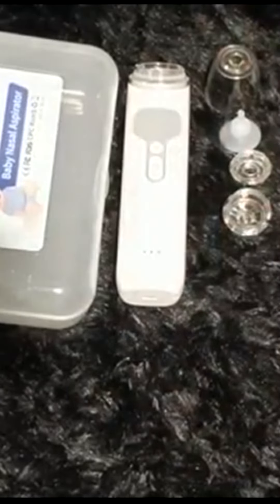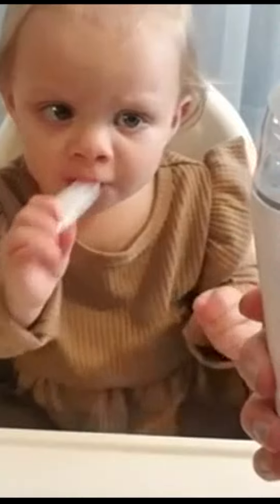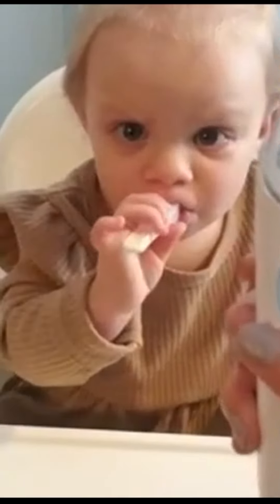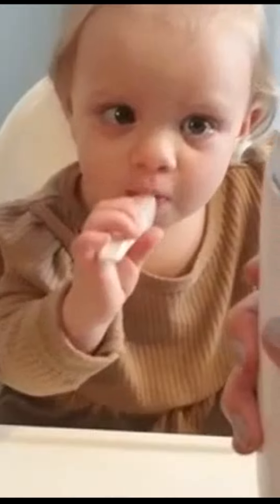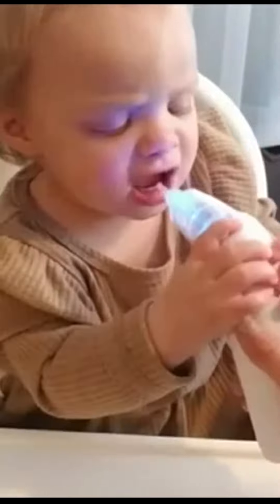To turn on the nose aspirator, press and hold the power button — you can hear the noise turn on. There's also a light button that changes the light, which you can turn on or off. There's a music button with many different sounds to distract your child while getting their nose clean. In the middle, you can change between speeds one, two, and three. The music and light really help distract your child.